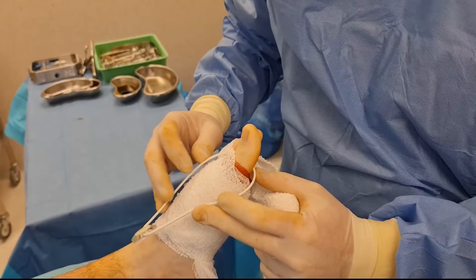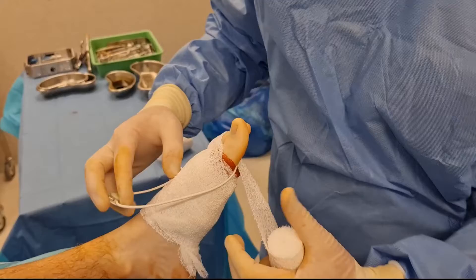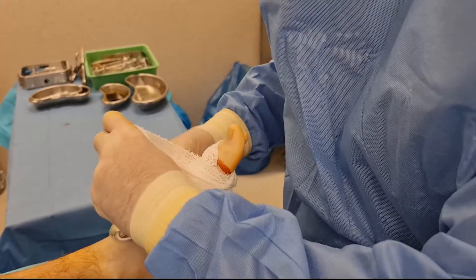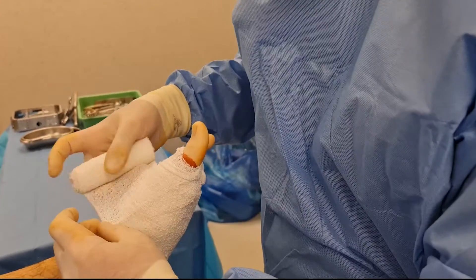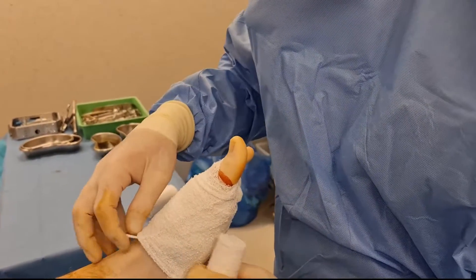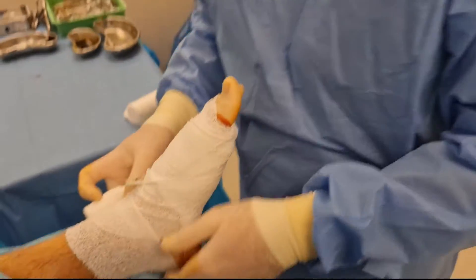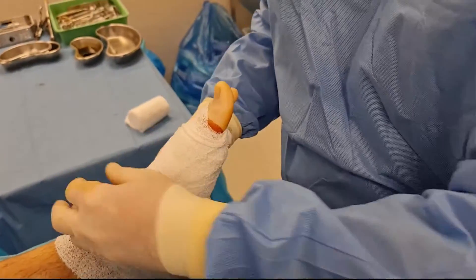It will pulse around about six to ten centimetres deep. This can be placed over bandages as long as they're not too thick — it can go a minimum of six centimetres deep, and that's where it starts to work on the active area. As you can see, it's being placed above the first couple of layers of bandaging, which is going to help the patient in their post-op recovery.